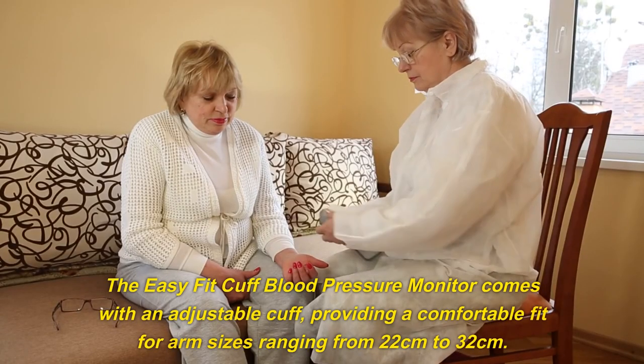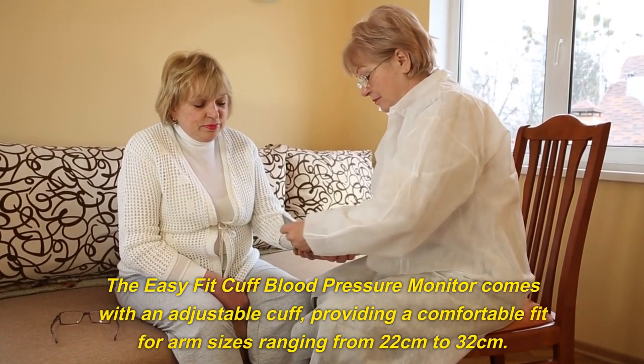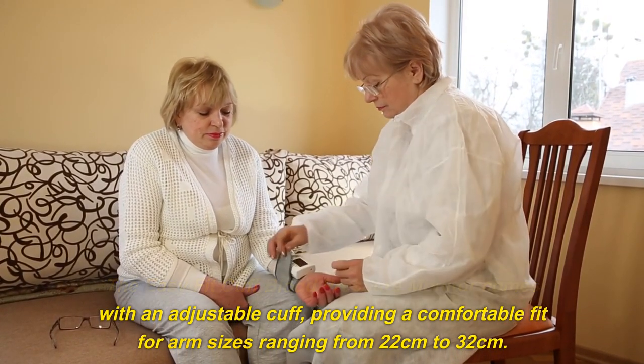The Easy Fit Cuff Blood Pressure Monitor comes with an adjustable cuff, providing a comfortable fit for arm sizes ranging from 22 cm to 32 cm.